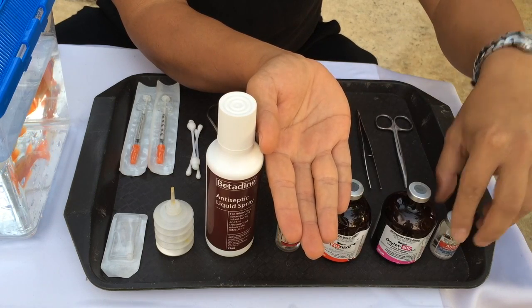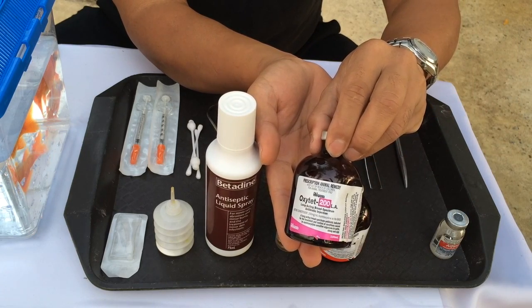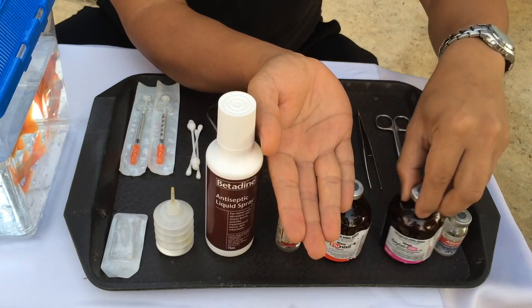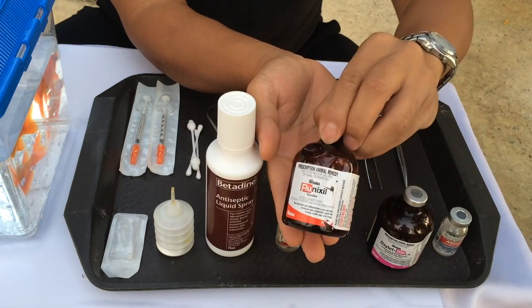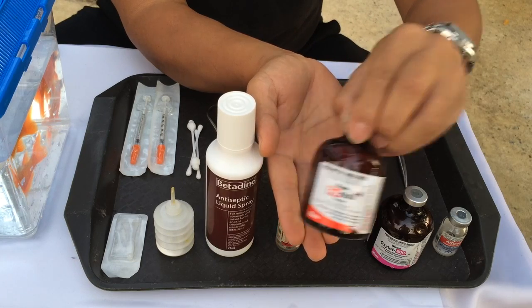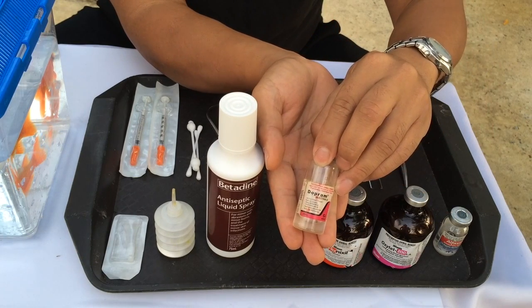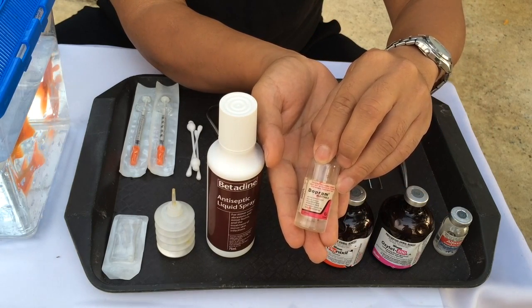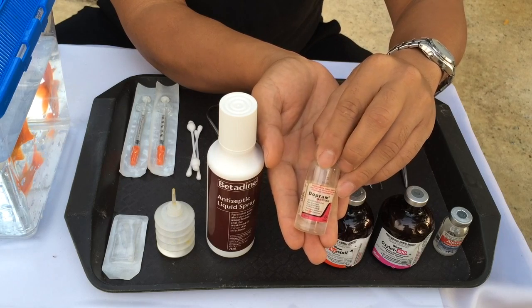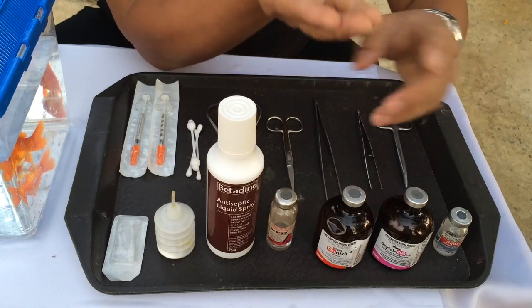As post-operative care, we're going to use antibiotics — I'm going to use long-acting oxytetracycline. And because it's going to be a painful procedure, I'm going to use flunixin, which is an anti-inflammatory. We also have doxapram here, which is a respiratory stimulant if the fish goes too deep under anaesthesia.